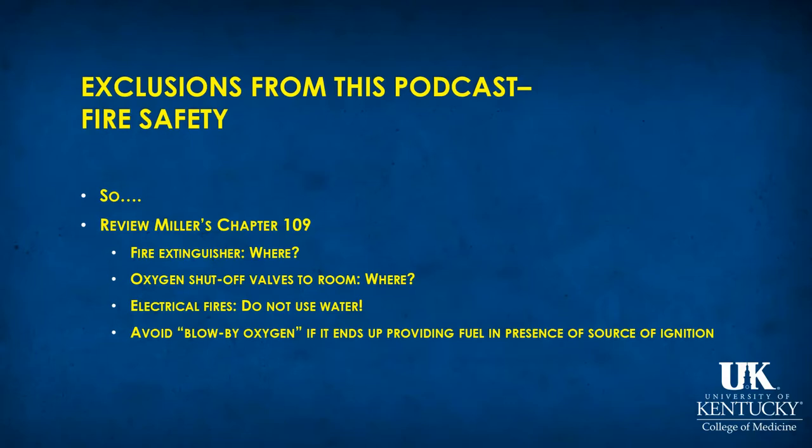And more recently, with the resurgence of oxygen-powered fires in the operating room, it's recommended that if you are using blow-by oxygen during a case of sedation, it should not end up providing fuel in the presence of a source of ignition.